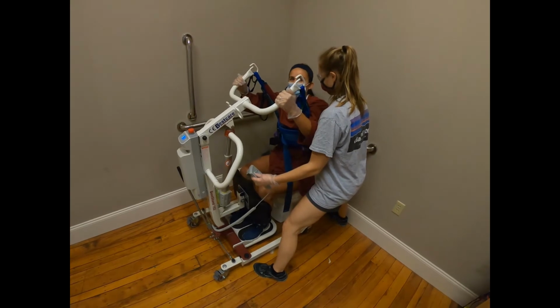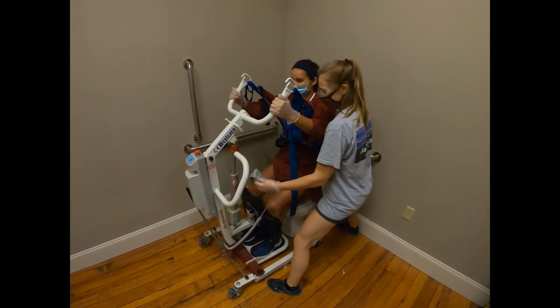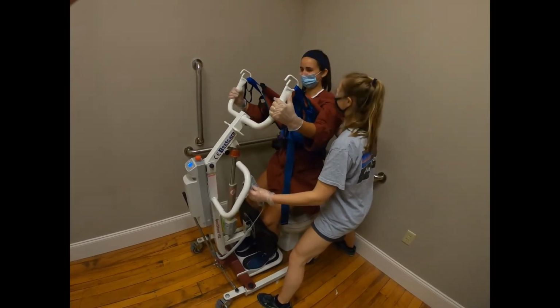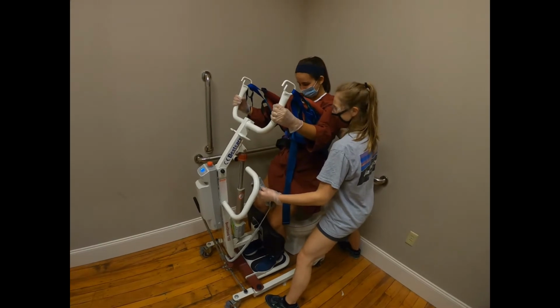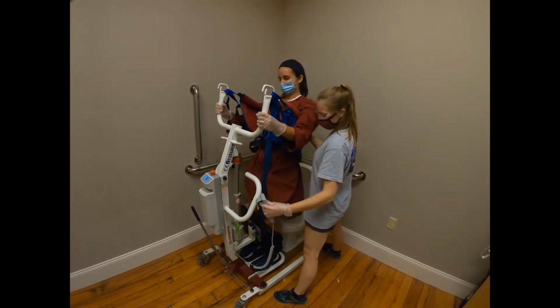As far as getting the patient from the toilet back to the standing position, it's as simple as using the controlled remote to raise the patient. You can provide additional back support using your hand as well. Once the patient is in the stand-up position, you can unlock the brakes and transfer your loved one to wherever they need to go.